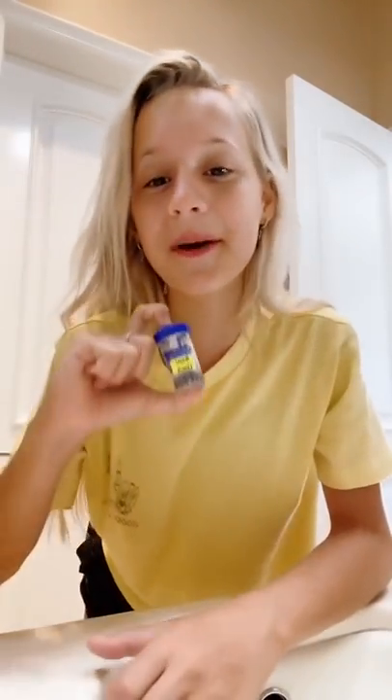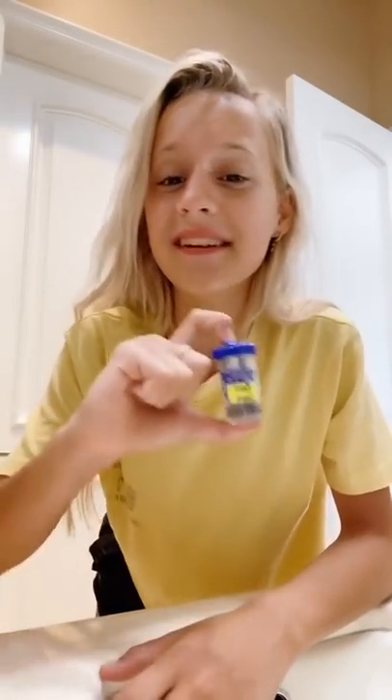Hey guys, a lot of you were concerned about me wearing contacts at night, but these aren't just normal contacts. They're actually called CRT lenses — you can look them up. You can only really wear them at night time, and if you wear them for 8 hours at night, you can see for 8 hours in the daytime. So they're actually really helpful for me.